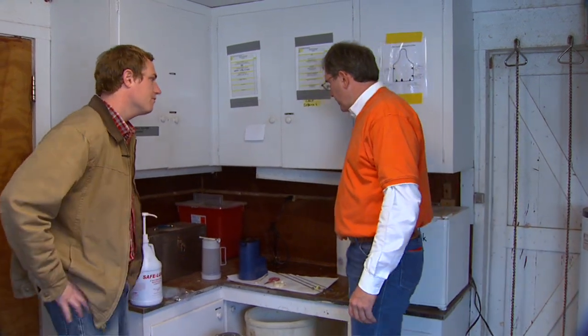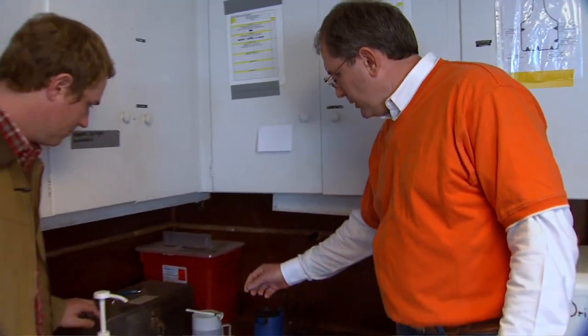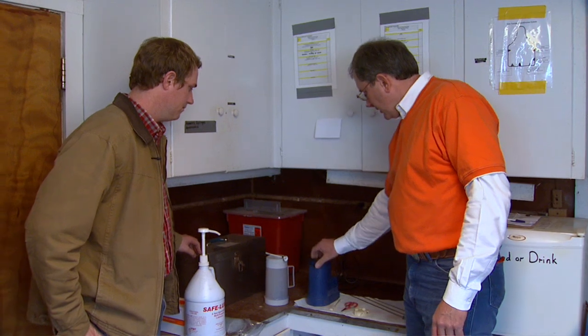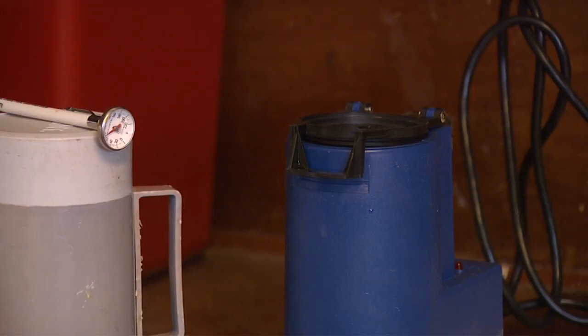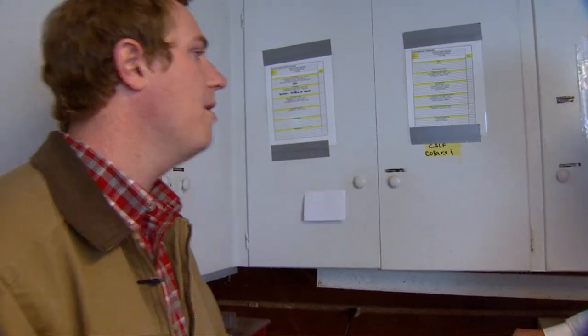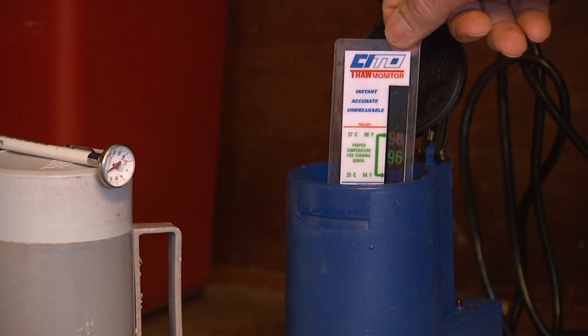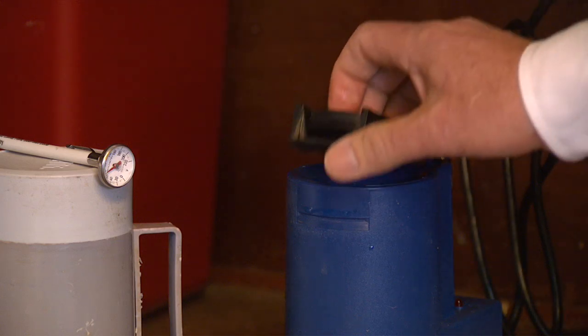Probably the most important thing is making sure we have the correct thaw temperature — I think that's something that people forget. It doesn't have to be elaborate; you can do something as simple as a thermos and a thermometer, or they do have units that are 12-volt or 110 that have a thermostat that's automatically set. The universal thaw temperature is 95°F for about 30 to 45 seconds — not a long period of time.